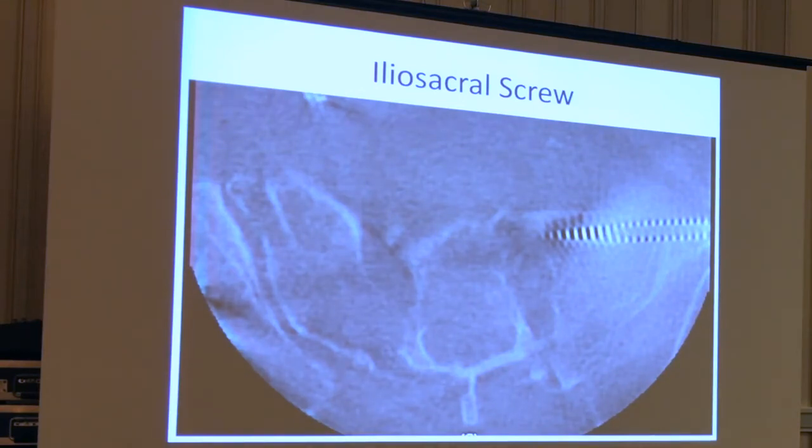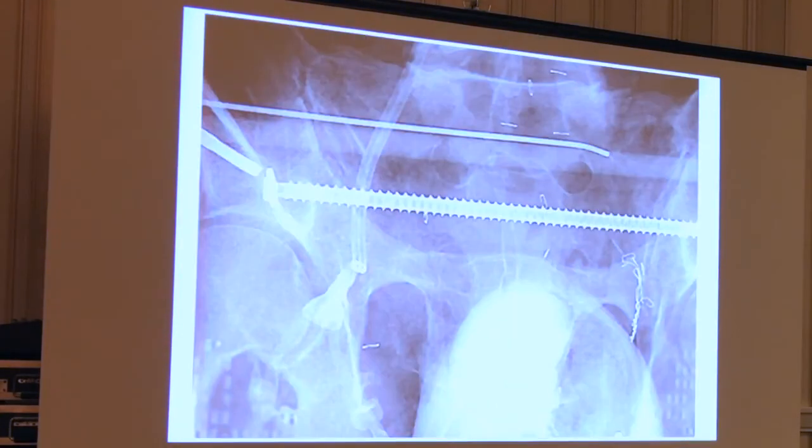This is his second sacral segment wire. It looks pretty good on that view, but it looks a little posterior on this view — for sure it is. I can look up and see that my screw that was ascending is out the other ilium. I've done about 8,000 ilio-sacral screws. I was never able to tell if I had screws extruded like this except on a post-op CT scan, which a lot of people don't even get. This is a really good thing for all clinicians to know. We can adjust the screw using the bent guide technique, and now we've got safe implants.